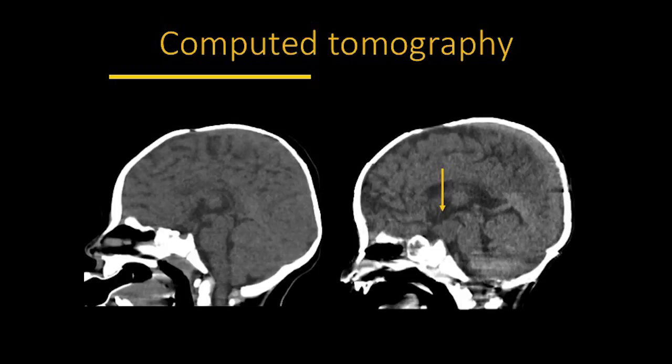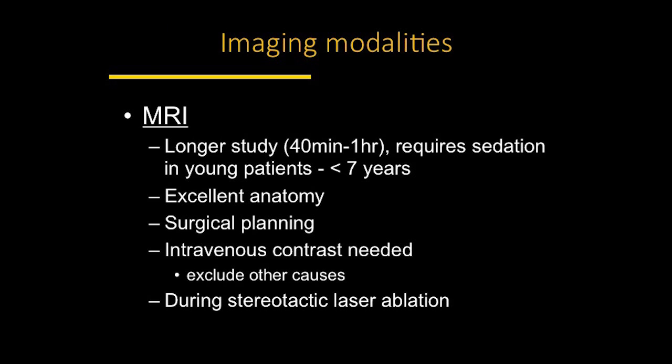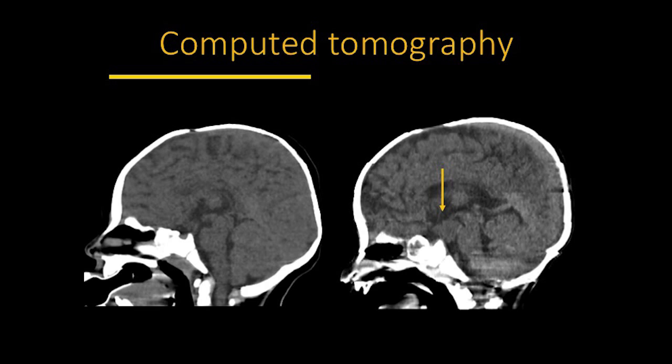On the sagittal CT — same orientation as the MRI — everything appears more blurred, all the same gray. We can see the suprasellar region, a little bit of the optic chiasm, and the mammillary body, but not as clearly as on MRI. In the patient with the hypothalamic hamartoma, we see the brainstem, mammillary bodies, and a fairly large hamartoma in the suprasellar system. But CT doesn't give all the information needed, so we follow up with MRI for better anatomical detail.